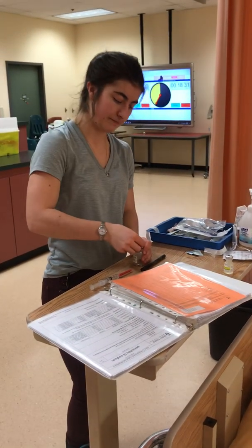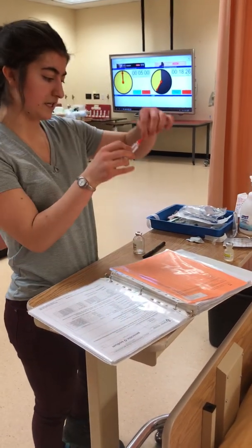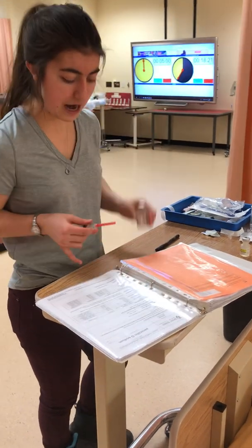I've got a new swab. I didn't really need one, but I just don't want to waste. So clean it for 30 seconds, let it dry for 15. I'm going to put the 3.1 mils in. One more time, double checking that I have the correct vial here.